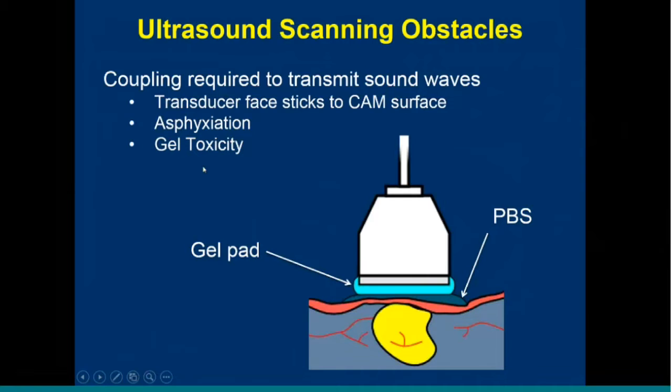We haven't really found a good solution for this yet. We've tried making a number of in-lab homemade gels with agar and agarose, but we haven't been able to get the consistency or the viscosity of the gel good enough for what we want to do. It's ongoing work, so we haven't gotten a good solution to that.